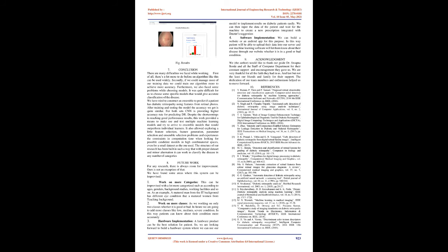We have tried to construct an ensemble to predict if a patient has diabetic retinopathy using features from retinal photos. After training and testing the model, the accuracy we get is quite similar. For both sets, CNN is providing higher accuracy rate for predicting DR. Despite the shortcomings in reaching good performance results, this work provided a means to make use and test multiple machine learning models and try to arrive at ensemble models that would outperform individual learners.